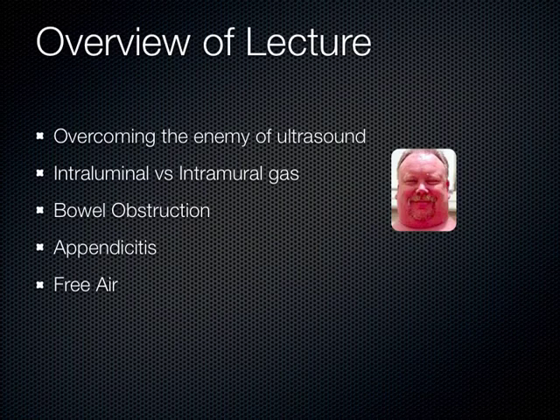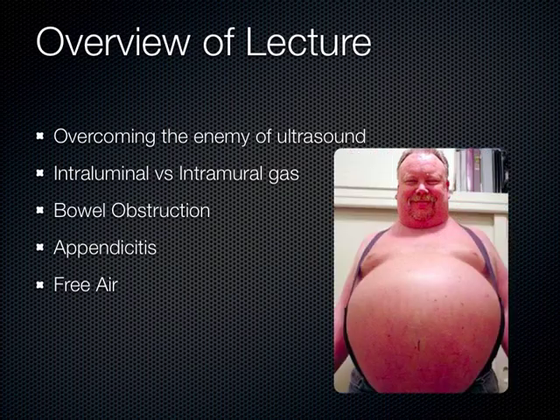But first of all, what you need to learn is how to overcome the enemy of ultrasound, which is the bowel gas. Sometimes it's pretty significant how much bowel gas there is. So for this gentleman here, that's a lot of air going on in there probably. And no matter what you do, you may not be able to do an ultrasound on certain extreme ends of the body habitus spectrum. That's just a limitation of ultrasound sometimes. But the majority of the time, patients don't have this body habitus, and you can get into their abdominal areas with ultrasound.